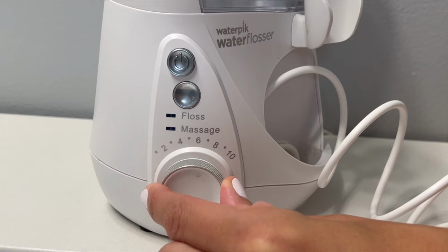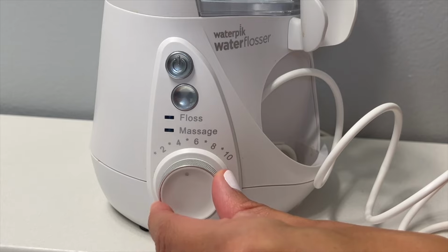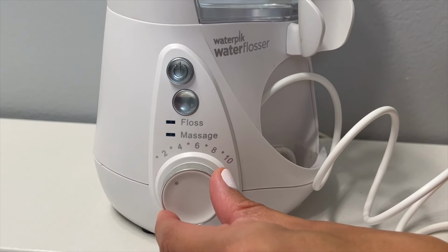But if it feels too gentle and you want more, of course turn it up. But if it's hurting you or you feel like you're power washing your gums and it's stinging and uncomfortable, then turn it down. You should never use a setting that hurts. Everyone's gums are different. Everyone will respond differently to different settings. The best advice I have is to use a setting that feels like a comfortable massage, that feels good. You don't have to power through it if it hurts on a high setting. Turn it down if it hurts.